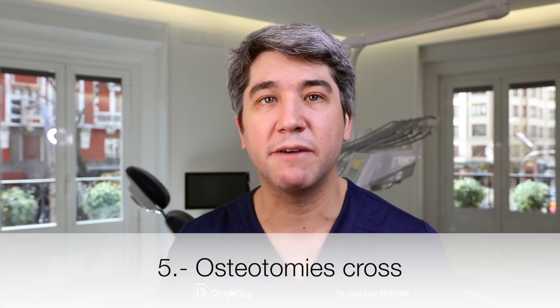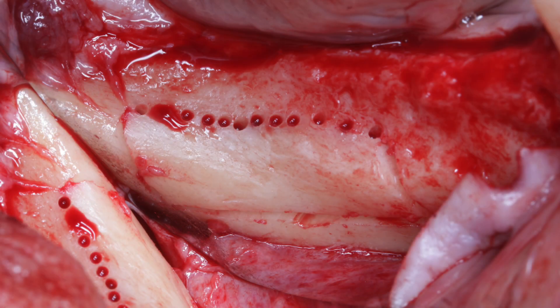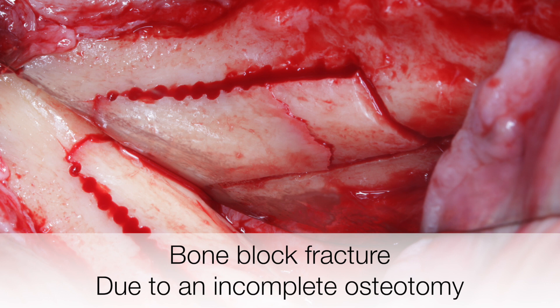The fifth tip is that no matter what device you use — Micross or piezo — you must be absolutely sure that all your osteotomies, both vertical and horizontal ones, cross each other. That's absolutely mandatory. Why? Because if they do not cross each other, you will struggle when harvesting the bone block — the bone will not come out easily. So only when you are 100% sure your osteotomies are crossing each other should you start using your chisel to harvest the bone block.